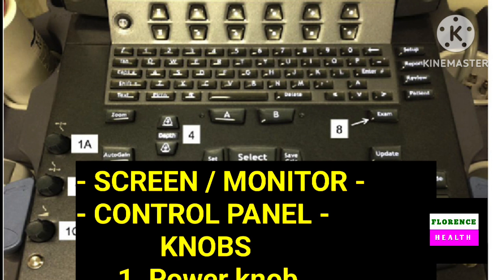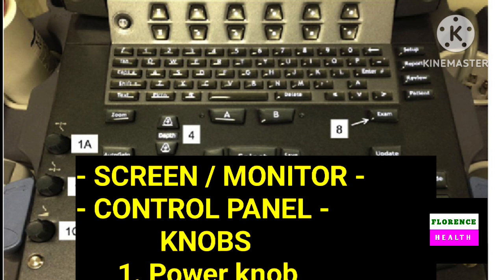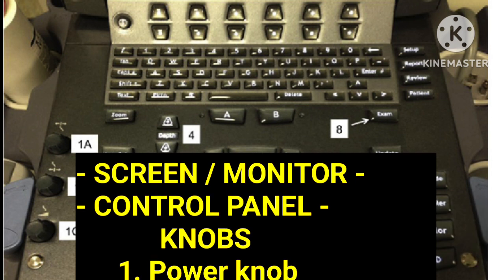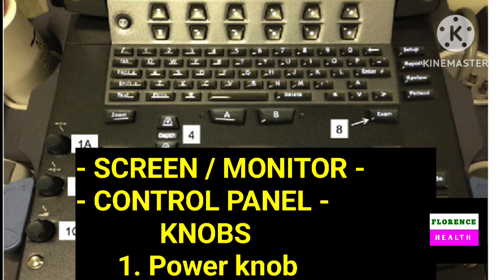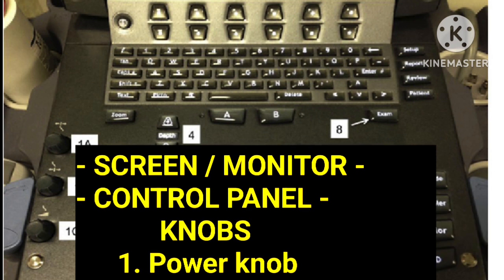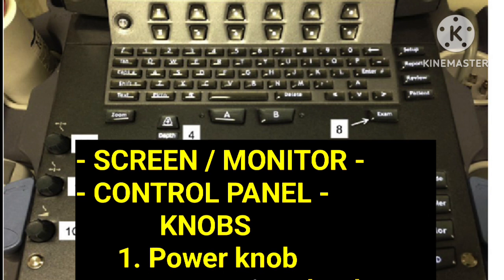Third knob is the preset knob or preset button. By pressing it, you will go for gynecological or musculoskeletal or abdominal examination. Remember, by pressing the preset knob, you will go for gynecological or any other part of examination.